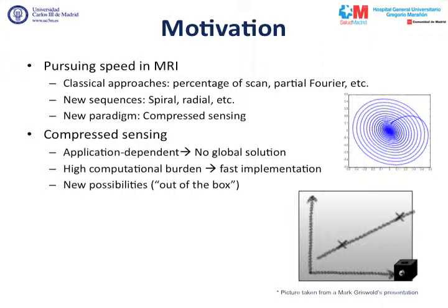However, it's a very interesting technique to me. I like it very much because it's very application dependent. The technique takes benefit from the spatiotemporal structure or information in the image, so you cannot so easily blindly apply a mathematical solution to every problem. Every problem is different, and there's a lot of room for imagination and creativity in terms of getting the best from the technique in every possible application.